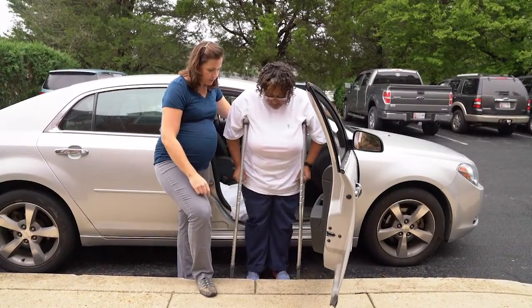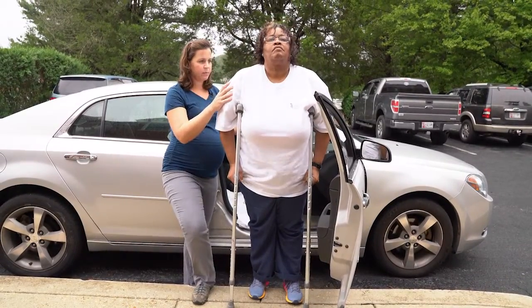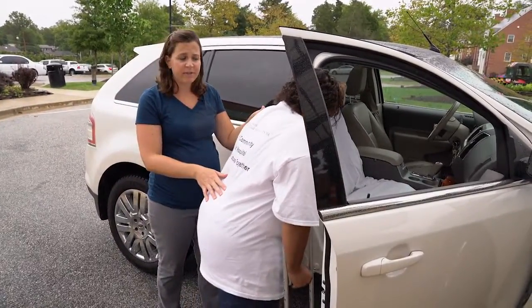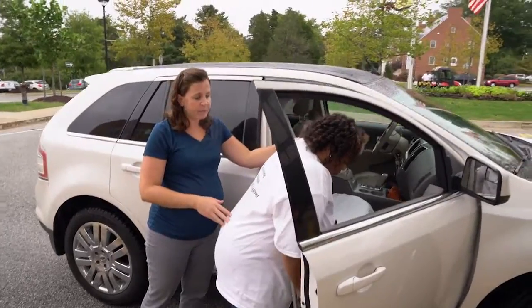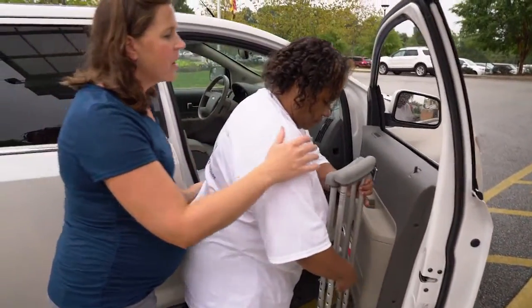So let's step up with our good leg. Good. All the way up. Bring the crutches, everything with you. Perfect. So getting into an SUV is a little bit different than a car. The height of the seat is going to be a little bit higher. Just be very, very patient with your family member. Keep turning.